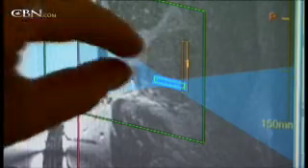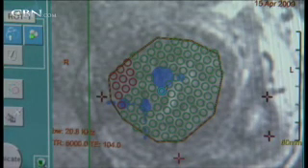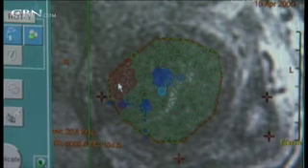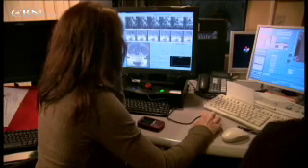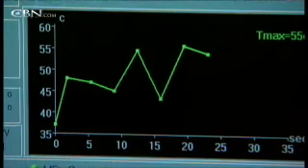This is the beam path going in, and this is the beam path going out. The results? The blue spots are already done, the green circles are future targets, and the red ones, I have to angle the beam differently because right now it's overlapping one of those intestine areas that we talked about, so that's telling me I can't do it right now. LeBlang carefully monitors each hit on Robin's 4 uterine tumors. She proceeds bit by bit until the tumors are burned out.